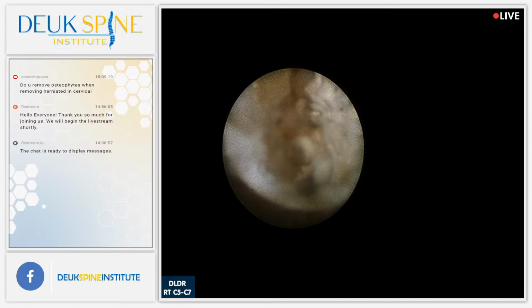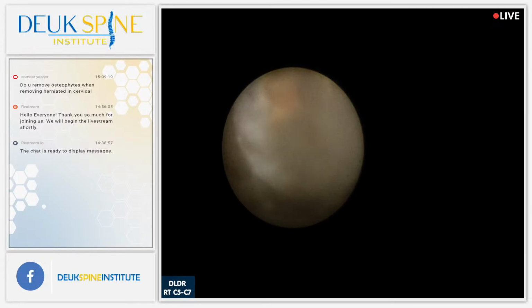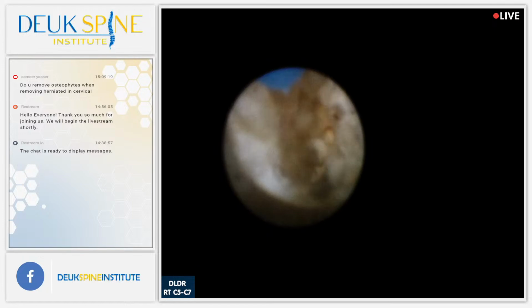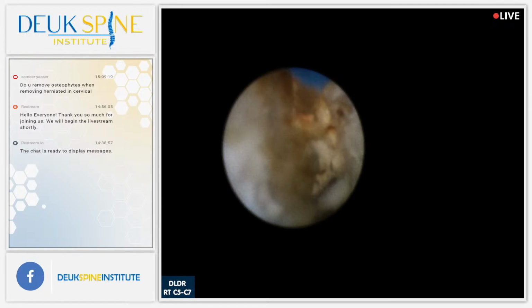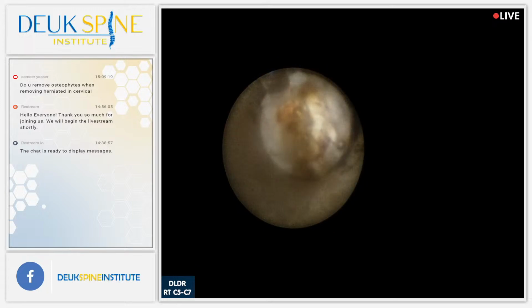I need you to help me here. Forget about that. Push the chest. Yeah. I'm having a hard time reaching back because his chest is so barrel big and it's blocking my scope.